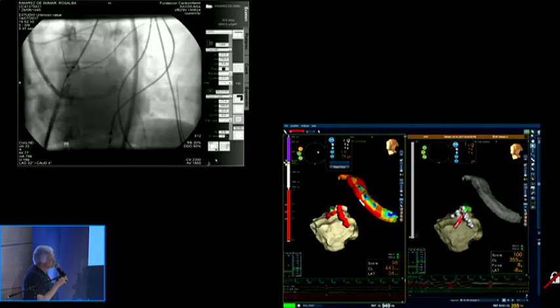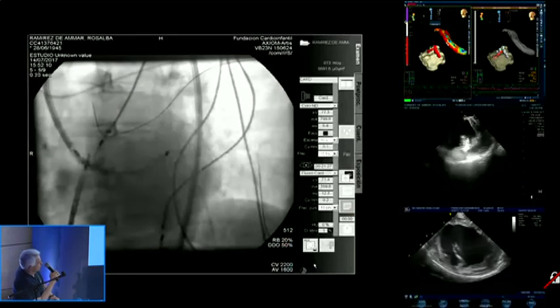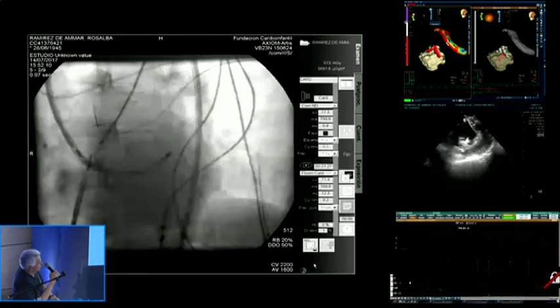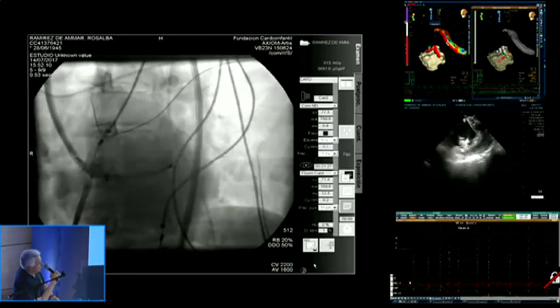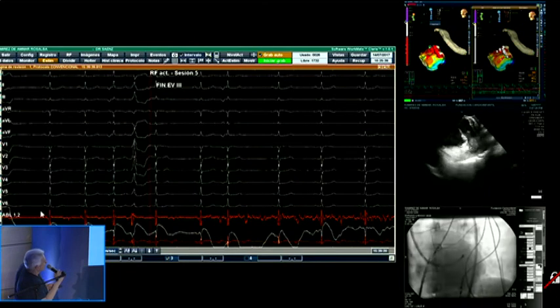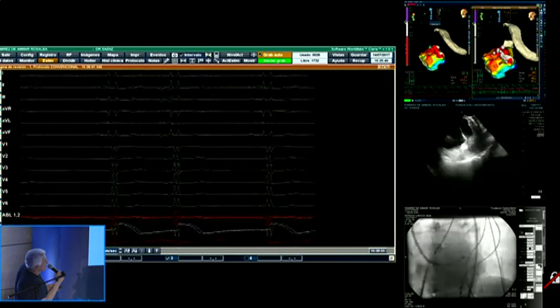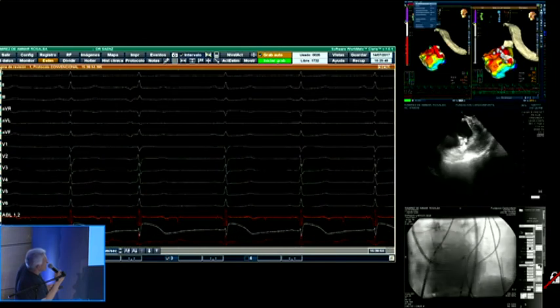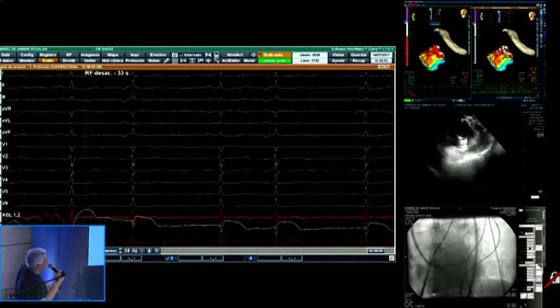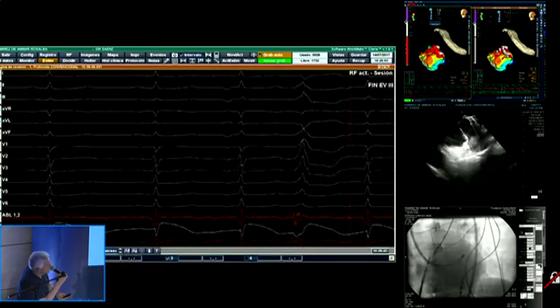So I don't know if you can show us 4 screens, the echo and the echo image of the successful location right there, and the electrogram, also the electrogram, please. Fluoroscopy, give us a little screen and a big screen for the electrogram. Put it at 150. 150, please. And the extrasystoles. To the other side. To the right. Right there. Okay. So this is the location.